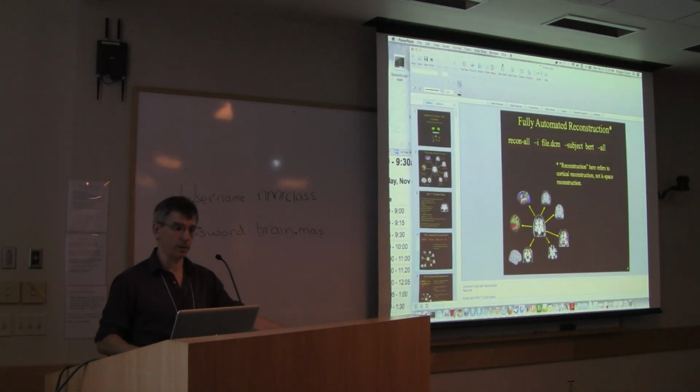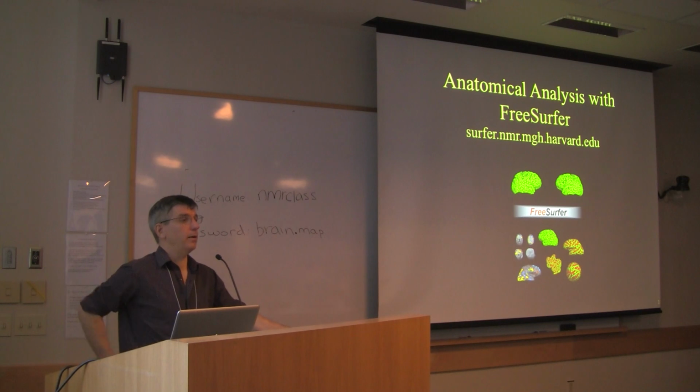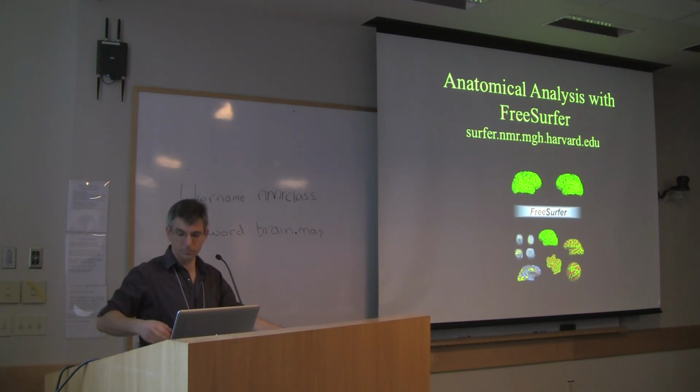Okay, so now what I'm going to be talking about is doing the first analysis with FreeSurfer. There are lots of things that you can do with FreeSurfer, including DTI, fMRI, and PET analysis, and hippocampal subfields, and all this kind of stuff. But all of it is going to be based upon the assumption that you have taken your input T1 image and run it all the way through FreeSurfer. If you want to go off and do group thickness maps or whatever, this is something that you will always have to do no matter what aspect of FreeSurfer you're going to be using.